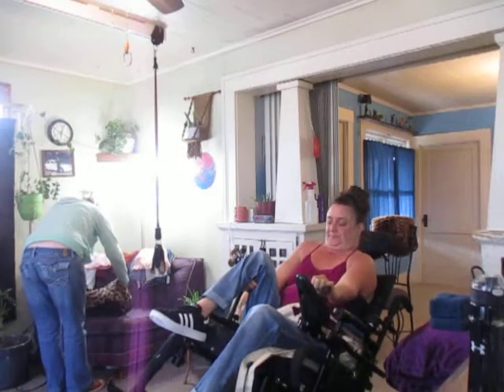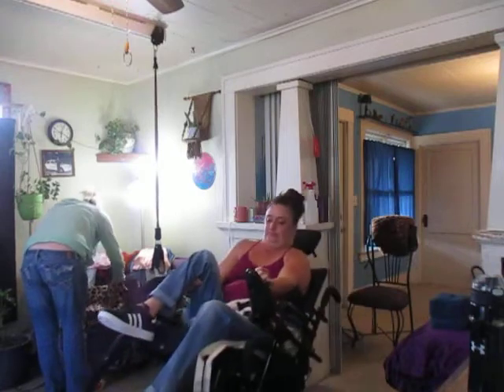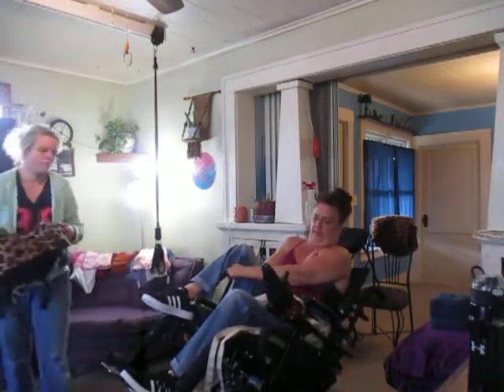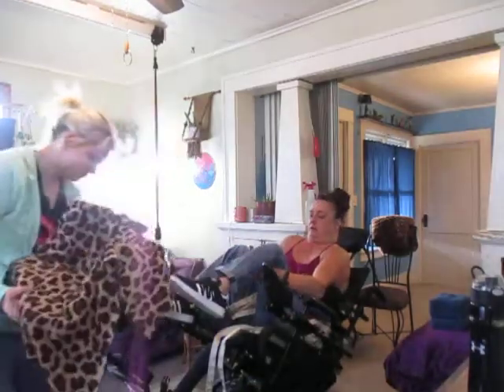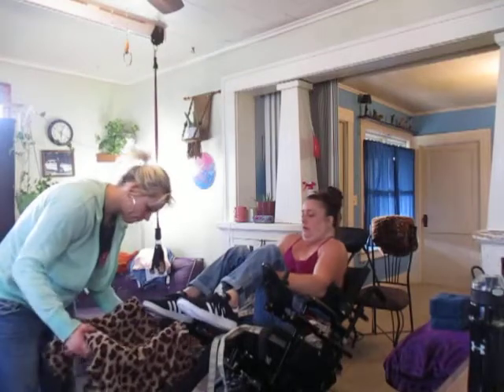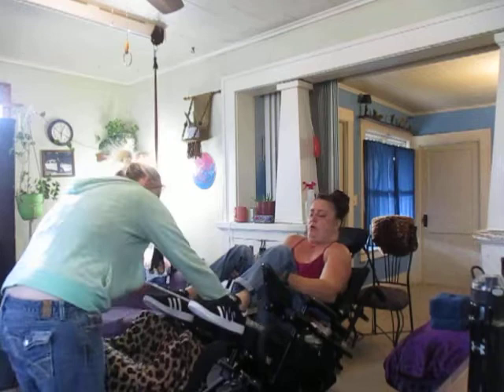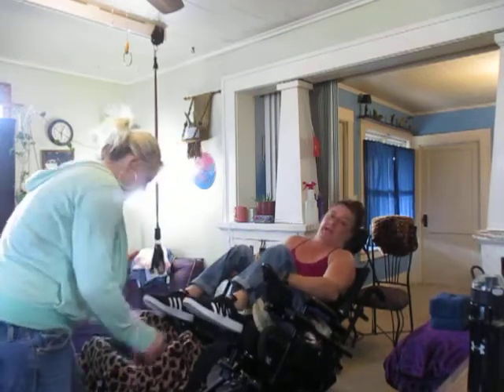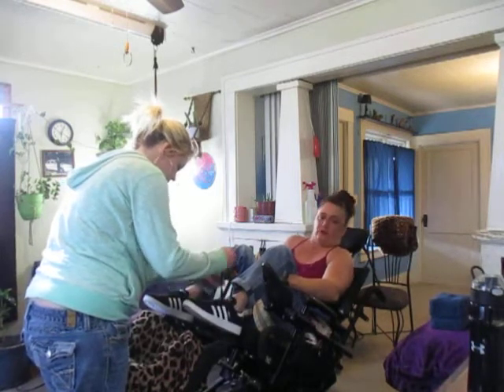I'm going to move to make sure you guys see. I got my comfort companion a couple years ago. It's really nice — when I take off my shoes, I used to use a pillow, but my ankles would tip out. I'm going to get lifted in a second here, and I'll show you how nice it contours my body.